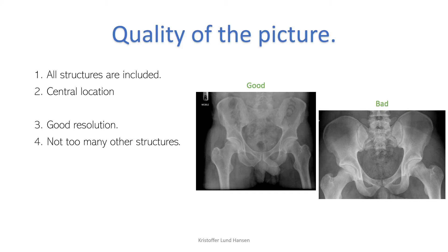To assess the quality of the picture you have to look at three things. All the structures should be included — you have to ensure that the appropriate anatomy is visible within the borders of the image, usually above the iliac crest to one-third down the femoral shaft. Both trochanters should be included.